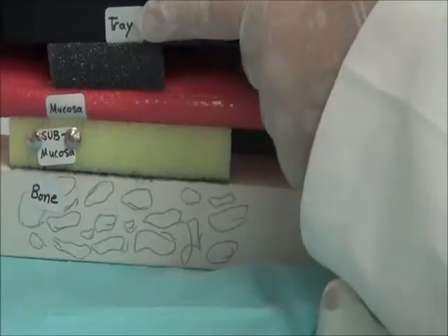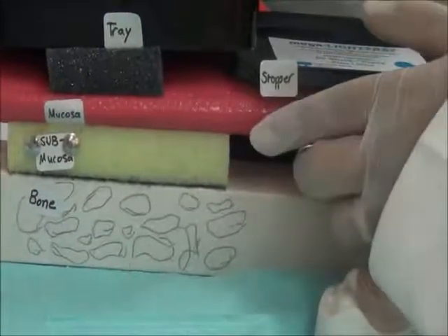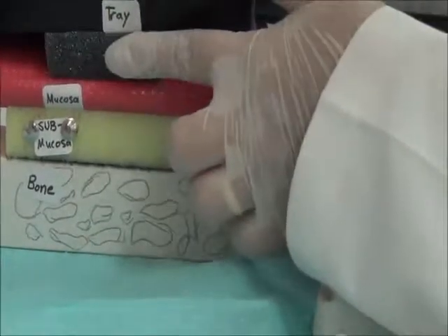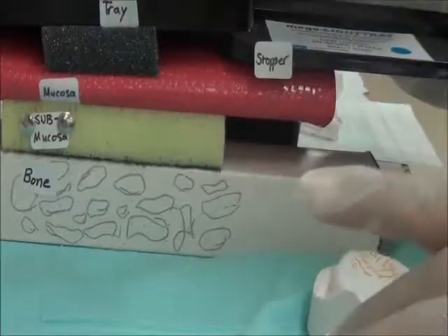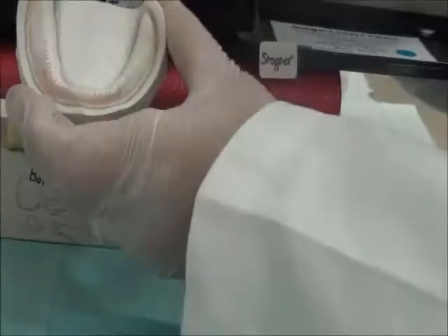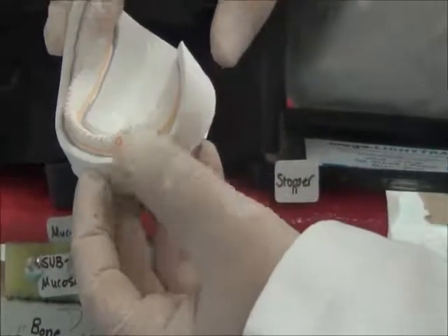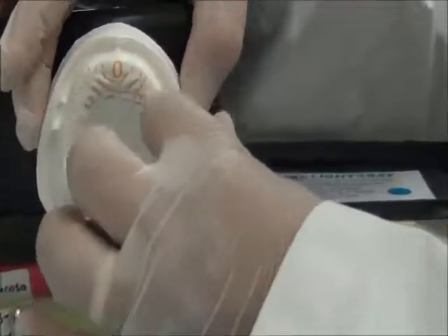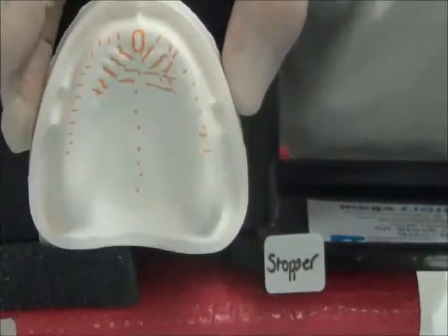So this relief that we made with wax maintained a space for the impression material to be equal in space, not exert any pressure on the mucosa while I'm pressing on the rest of the impression. The relief areas in the lower are the crest of the ridge and the mental foramen area. While in the upper they are the crest of the ridge, the incisor papilla area, rugae area, and mid-palatine raphe area.